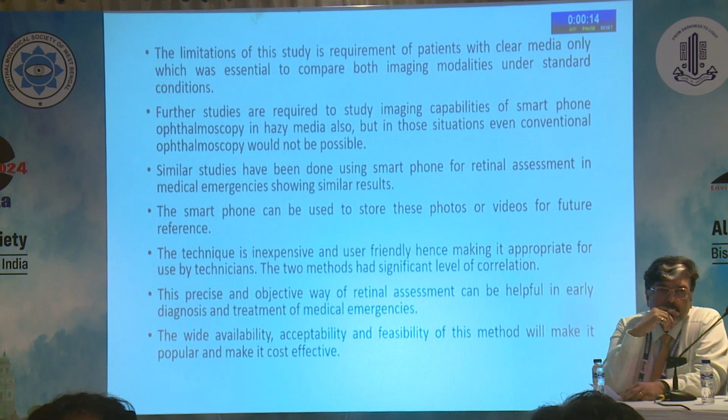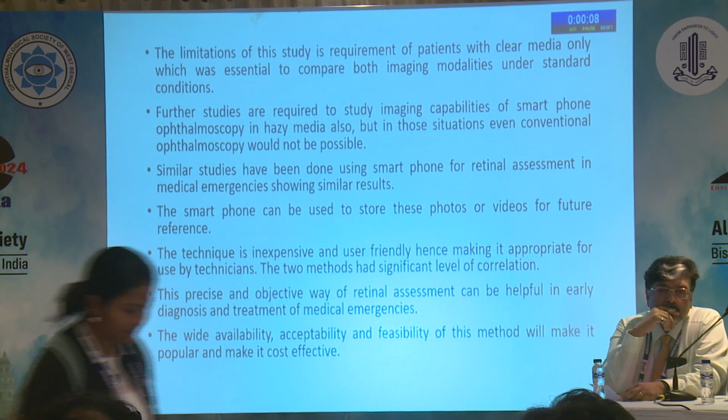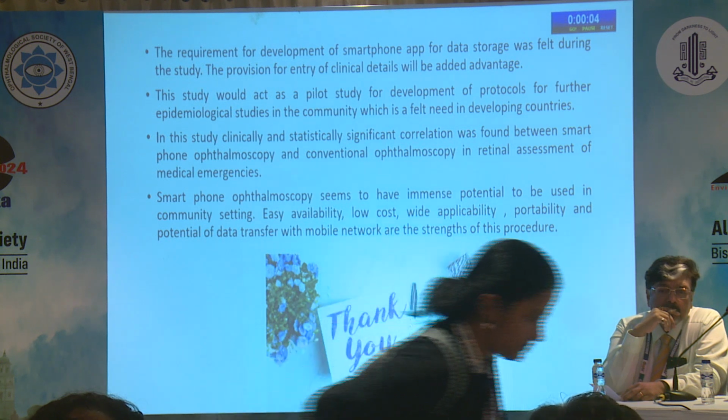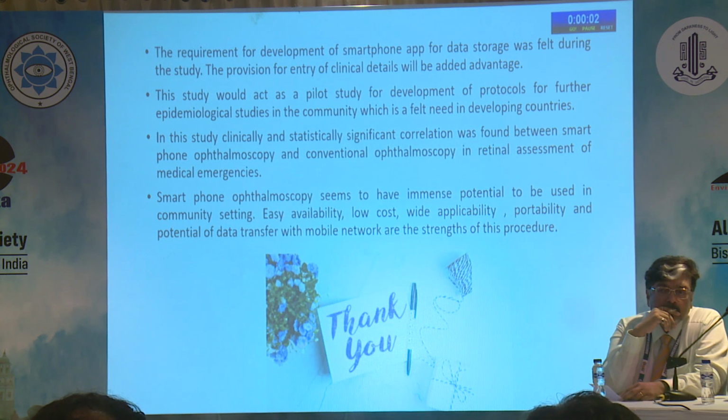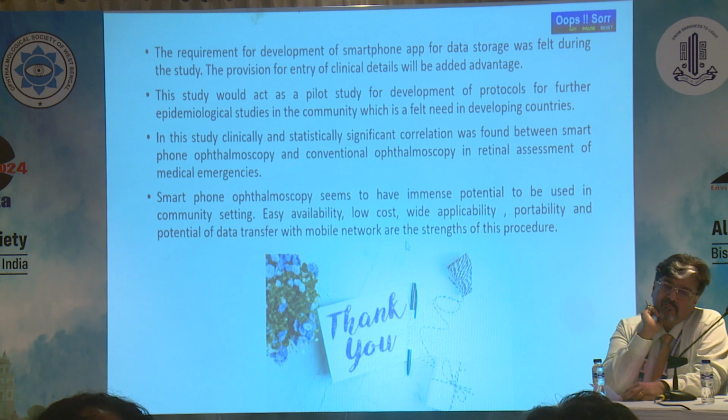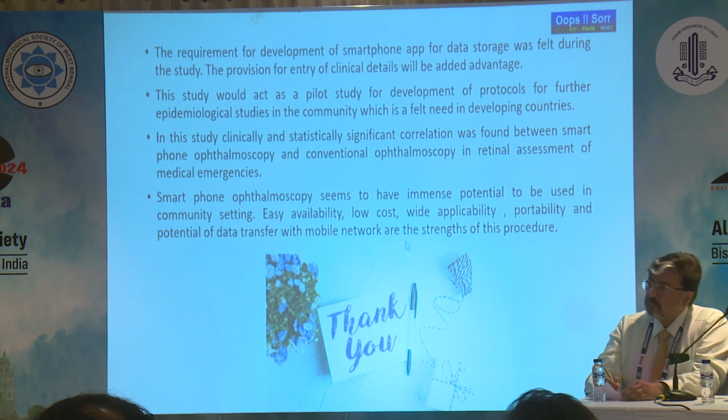The limitation of this study was the requirement of patients with clear media, which is comparable with both indirect and smartphone ophthalmoscopy. To conclude, a clinically and statistically significant correlation was found between smartphone and conventional ophthalmoscopy in retinal assessment of medical emergencies. Thank you.